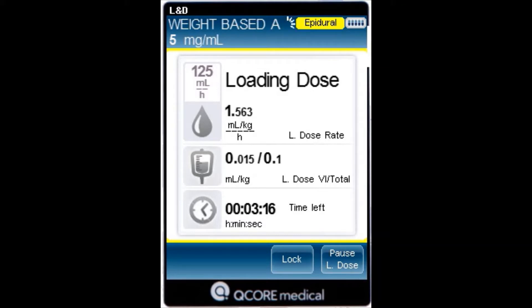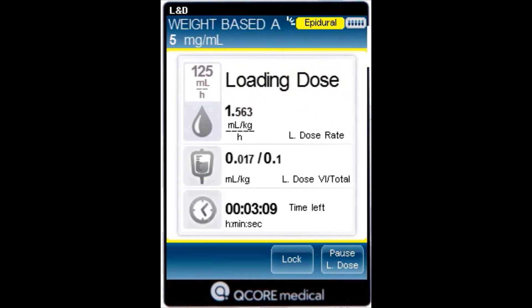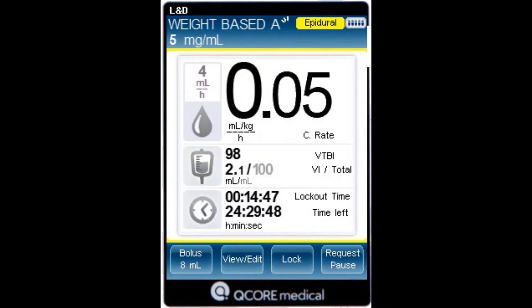Throughout a PCEA infusion, the current infusion phase — loading dose, running, bolus delivery, or clinician bolus — is displayed on the indicator bar. In addition, the following information appears on the screen.